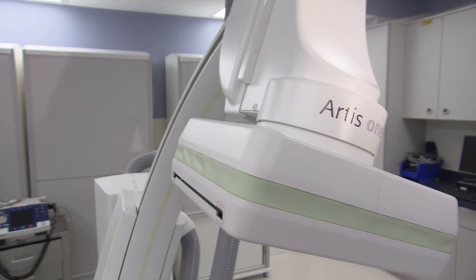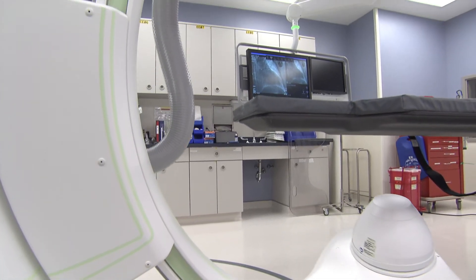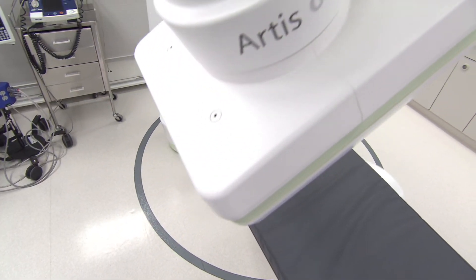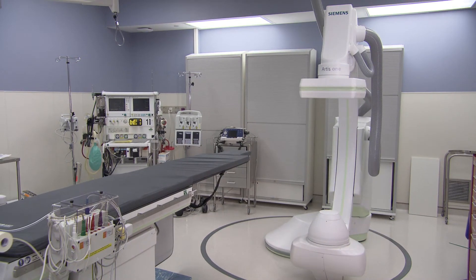We looked at several other systems when making our decision on which one to buy. The key things we considered: number one, the size of our room — we felt this was a better fit for the room size we have, because it gives you more flexibility. The other thing is this is a multi-purpose lab. We use it for coronary, peripheral, implants, and EP studies. Most of the EP studies and implants are done through the left side, so this unit really helps us work better from the left side.